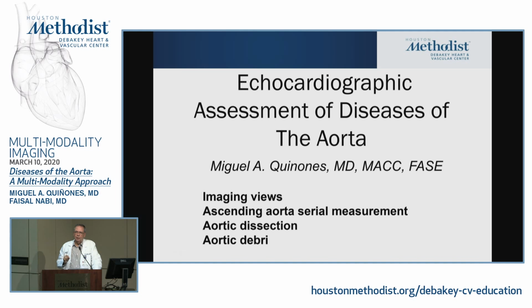We did it for many years, and I can show you a lot of cases where the radiologist missed it and we picked it up by TEE. So in that circumstance, the TEE is the king, if all you have available is a regular CT without gating done by radiology. I feel very strongly about that.